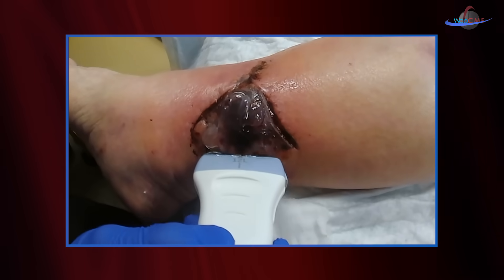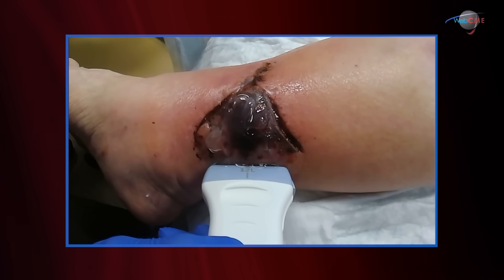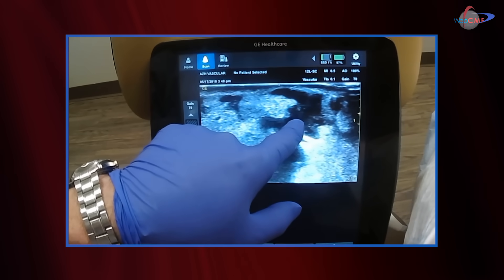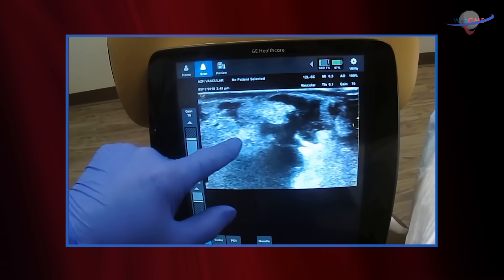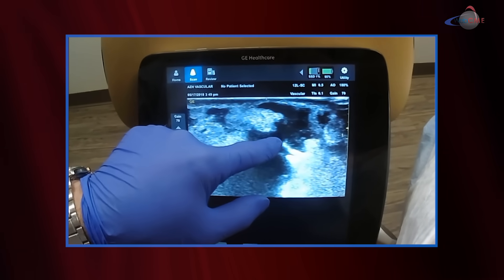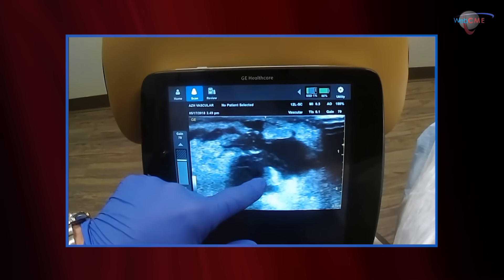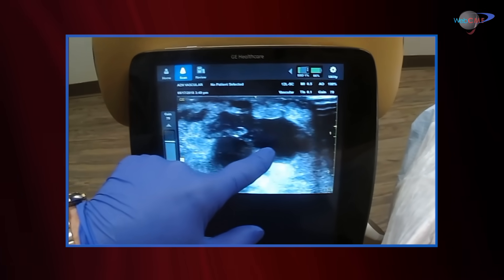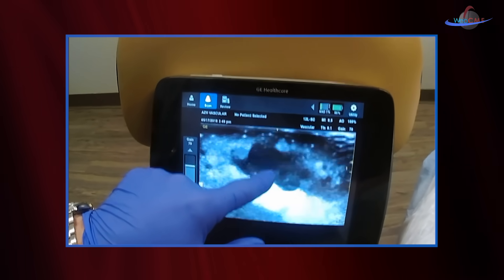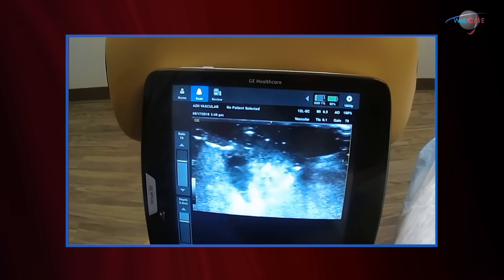Now we're going to come over the flap with the ultrasound and move the probe slowly over the necrotic tissue. I'm not going to push down hard. You're going to see a lot of changes in the echogenicity. Here we have the regular tissue echogenic markers, but this again looks more consistent with fluid. And this in fact is a seroma hematoma underneath that flap. As I suspected, we have a pretty significant area of fluid collection slash hematoma underneath that flap.